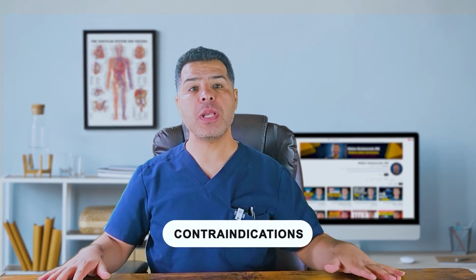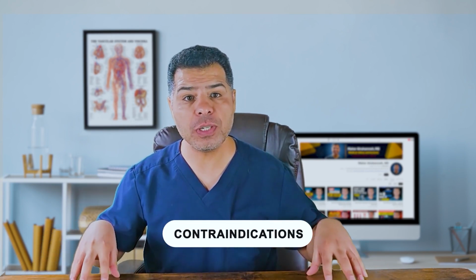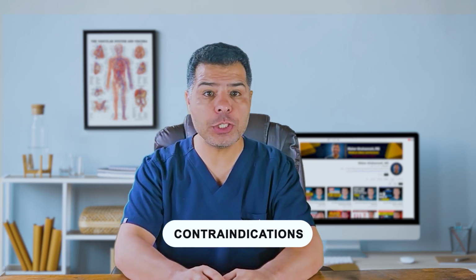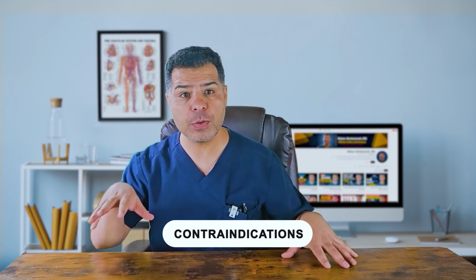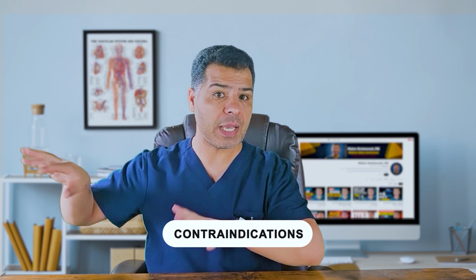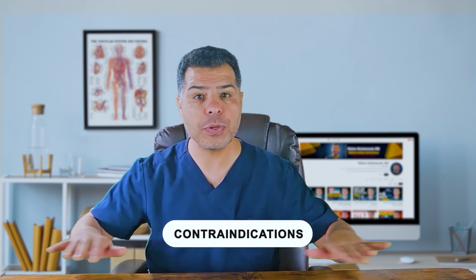How about bacteremia? If there is no existing line, a new non-tunneled central catheter can be safely placed under strict aseptic conditions. If there is an existing line, remove it first if you think it's the source of the bacteremia. This is for non-tunneled catheters. Never place a tunneled catheter or port until the bacteremia is clear.